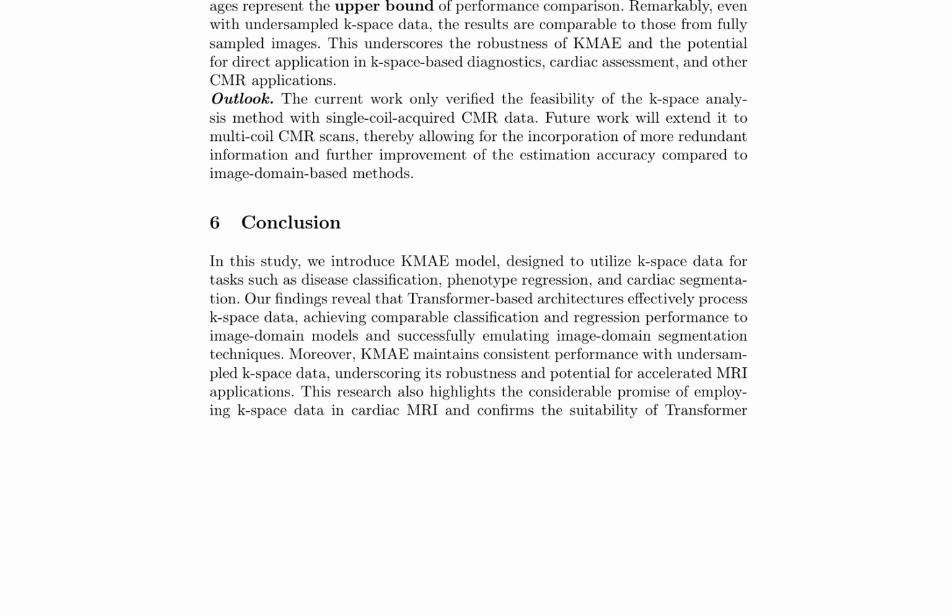Results from undersampled K-space data outperform those from fully sampled K-space, suggesting that the former focuses more on low-frequency components, which are crucial for downstream tasks. Predictions based on MAE for fully sampled images represent the upper bound of performance comparison, underscoring the potential for direct application in K-space-based diagnostics and cardiac assessment.